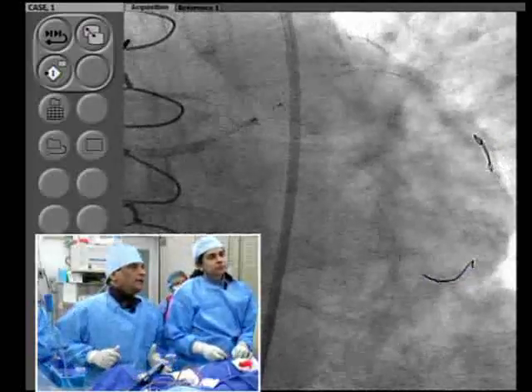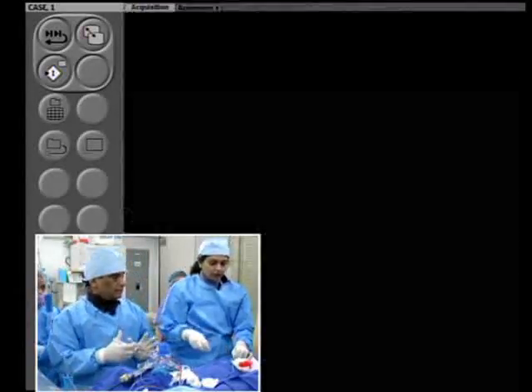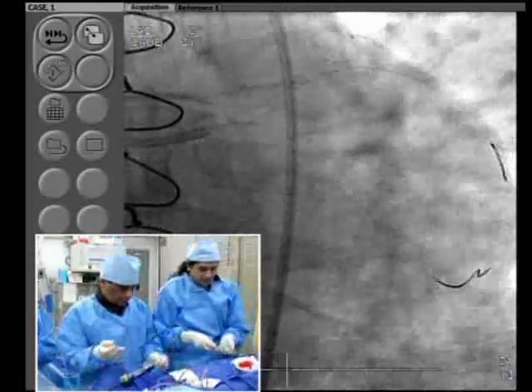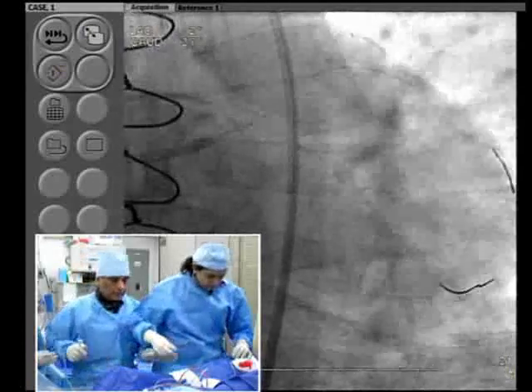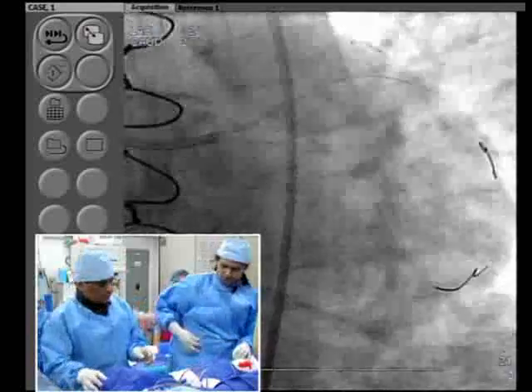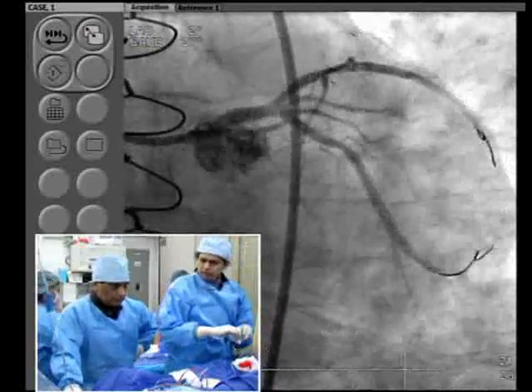Have you been using the AngioSculpt also for similar cases? Yes, not so much for the native ostial lesion, but more for in-stent restenosis, only because you are able to go to higher pressure with that balloon. Excellent. Sameen, another question for you: what is your standard equipment for a PCI that uses a drug-eluting stent with the pre-dilatation strategy? Which guide do you use? Which guide wire? Which balloon and which stent?